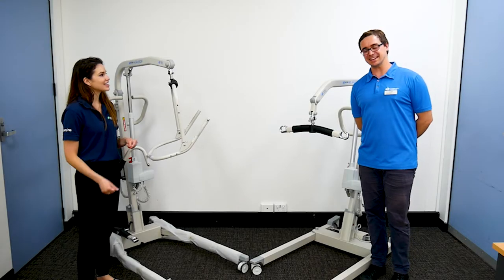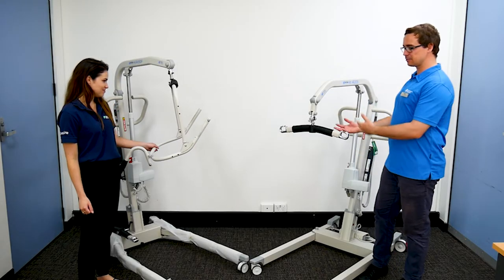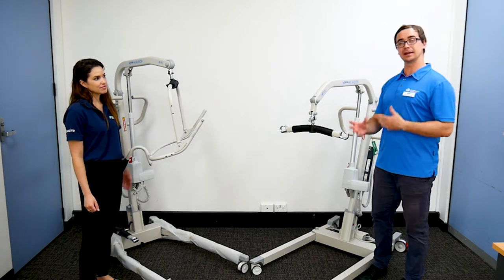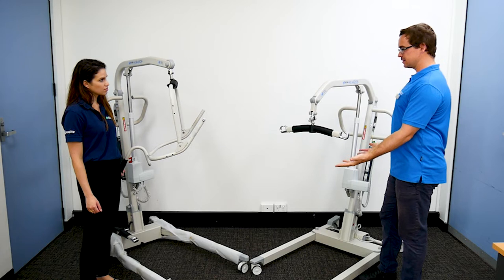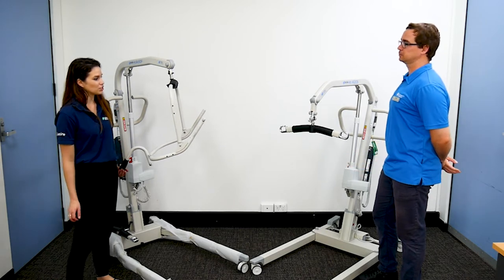We're here at Erena Adacare with Ali today, looking at a range of different lifters and giving a little bit of education in a short video. So what have we got here with us today?